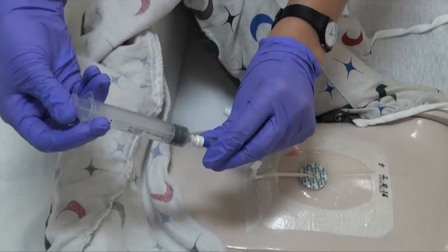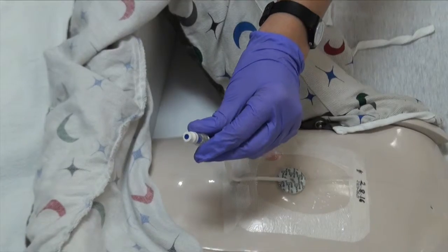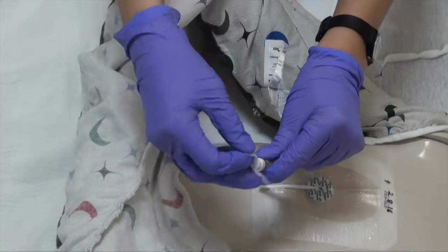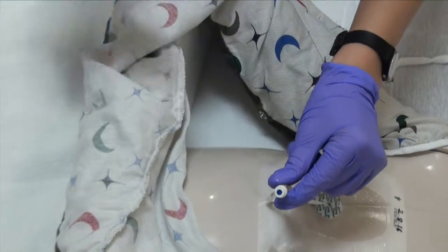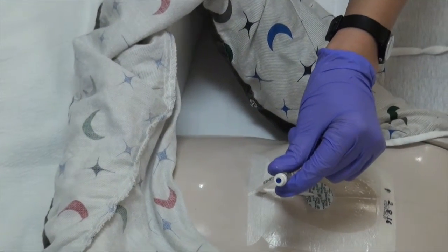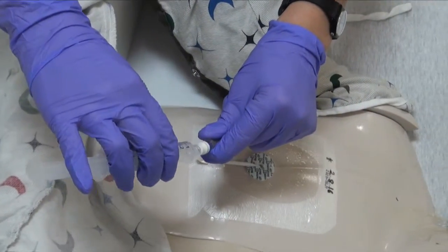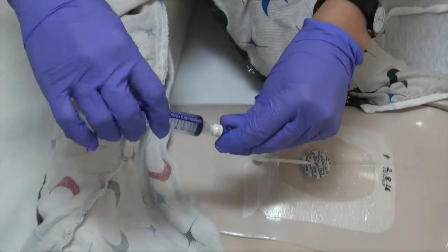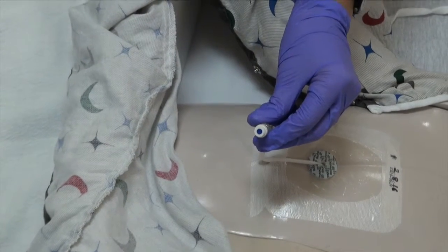You'll repeat the steps, starting with using a new CHG wipe and flushing with the heparin syringe. Apply a Curos cap if the line will not be in use.